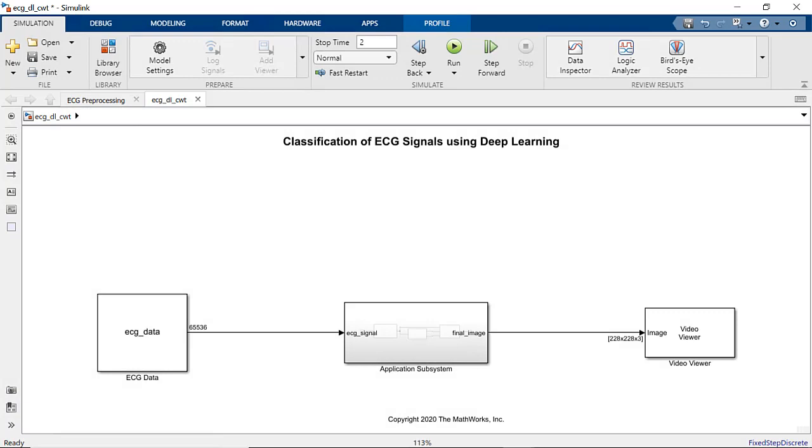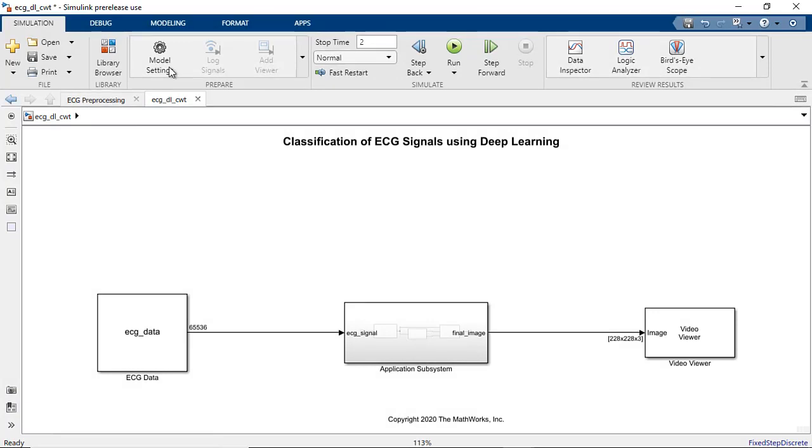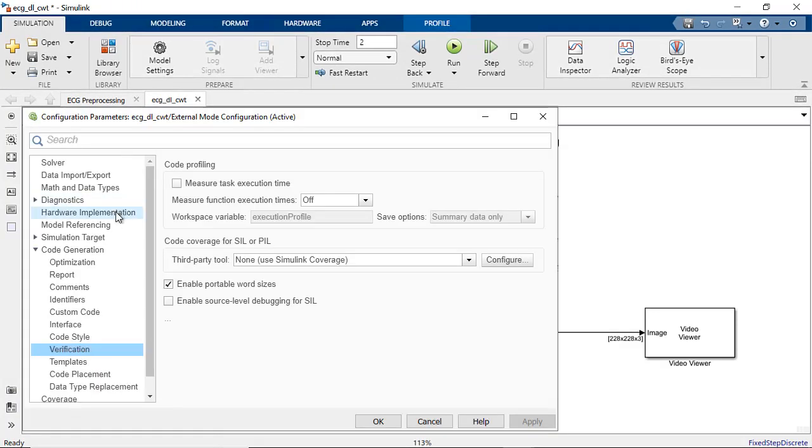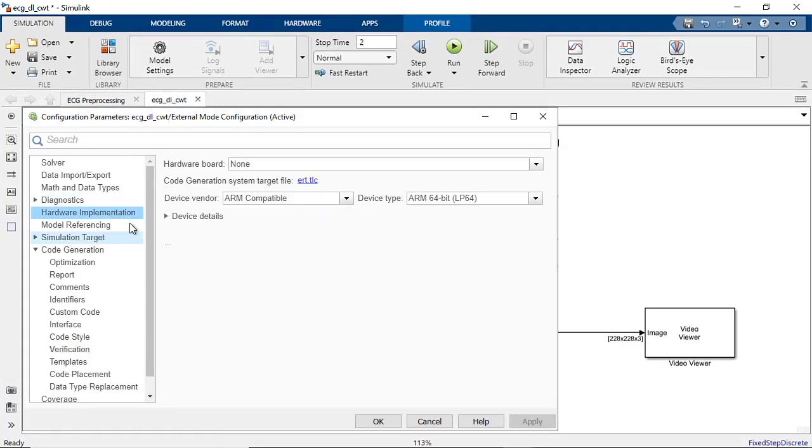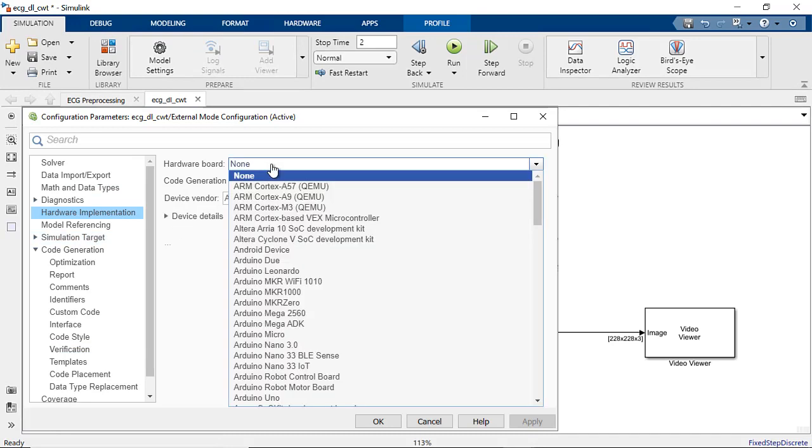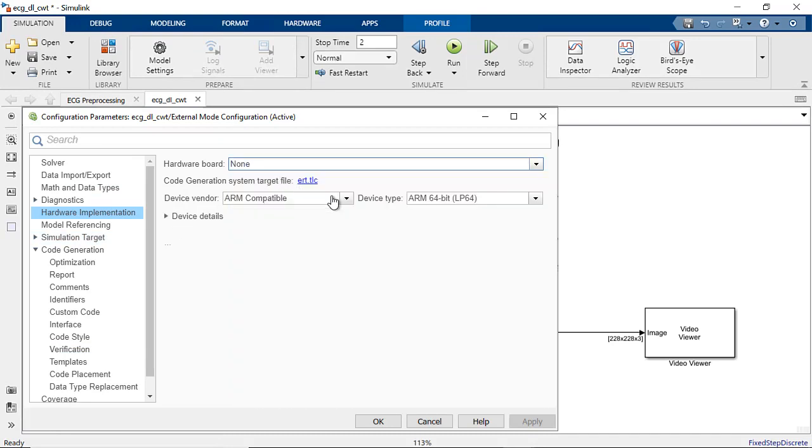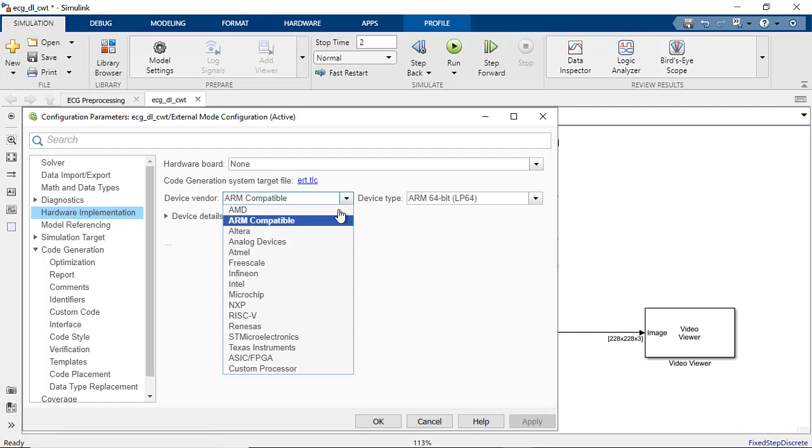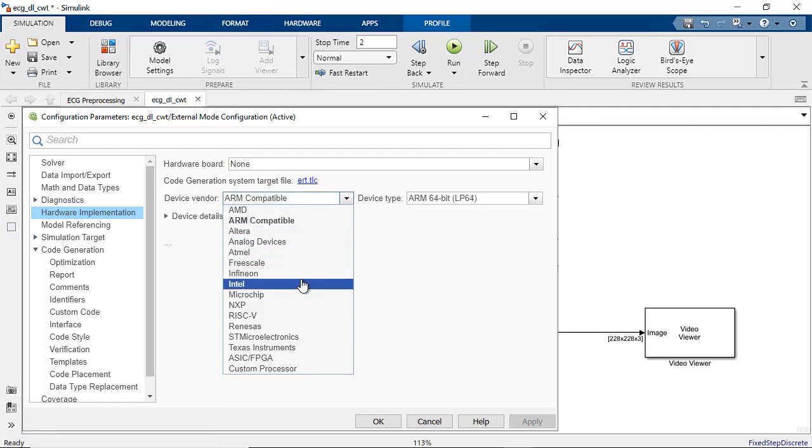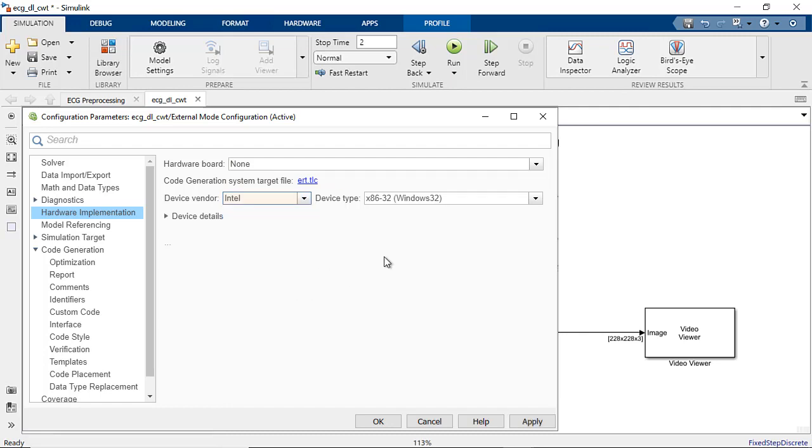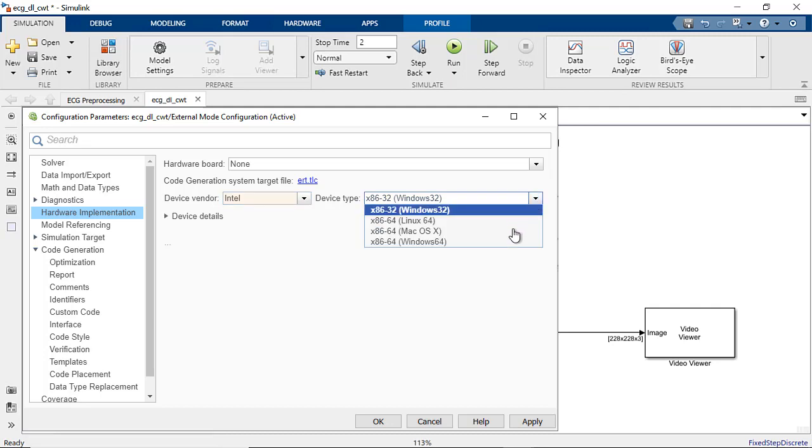To perform software in the loop testing, go to Hardware Implementation tab in Configuration settings. Set Hardware Board to None and set the device details to match your host machine. In our case, the host machine is a 64-bit Intel processor.